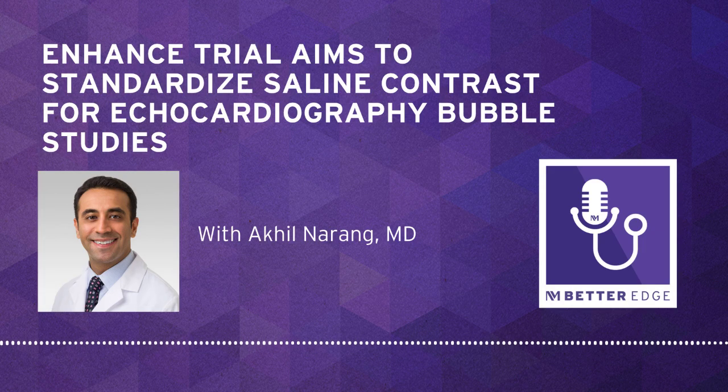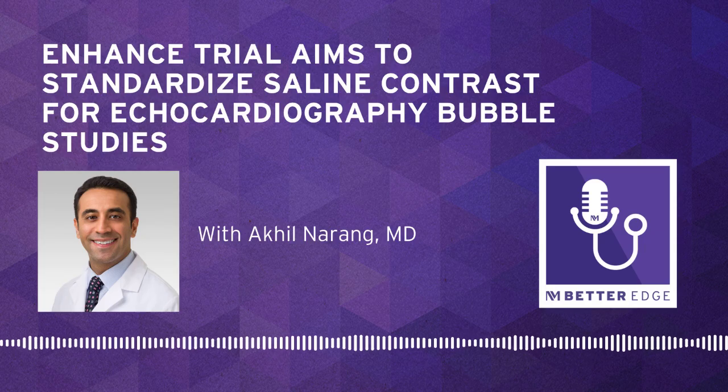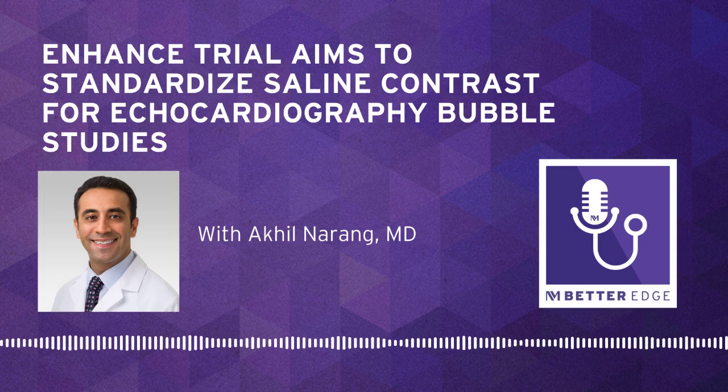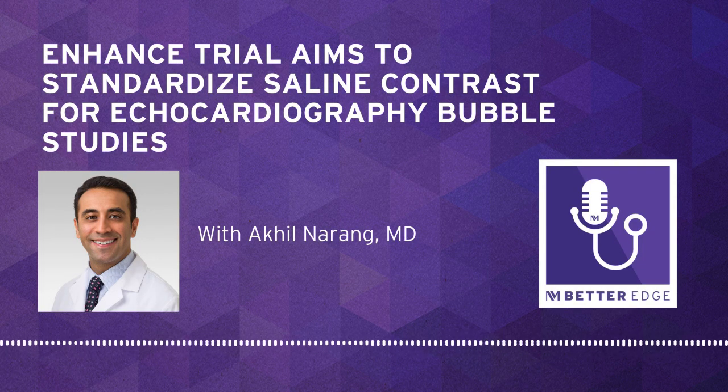You mentioned the many people involved and reproducibility. And how can clinicians expect the use of this new contrast agent to streamline those workflows that you were just discussing in the Echo Lab? Absolutely. So saline contrast is widely used right now, but it's highly variable depending on how it's agitated, injected, timed. And so this variability can lead to suboptimal opacification, inconsistent bubble size, and often non-diagnostic studies which lead to repeat imaging.